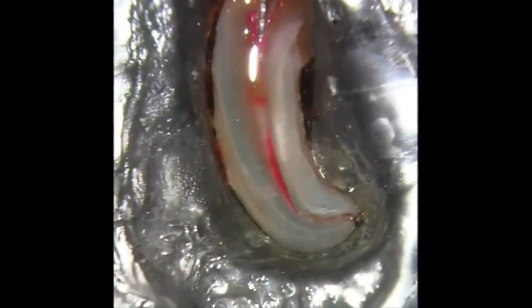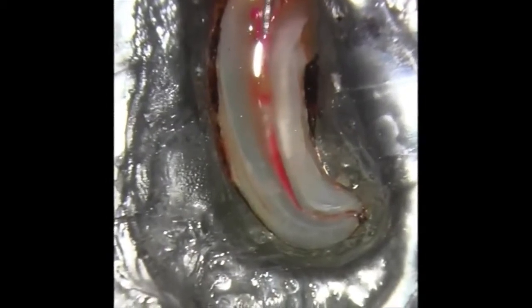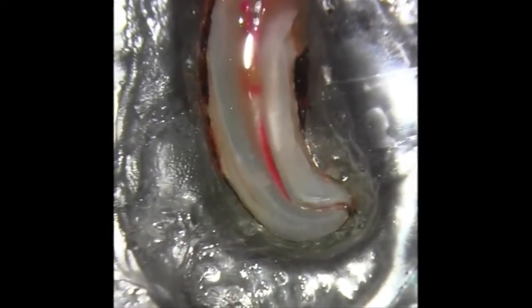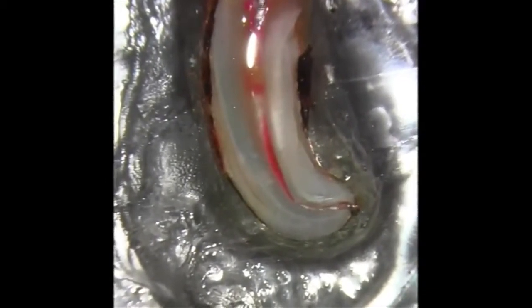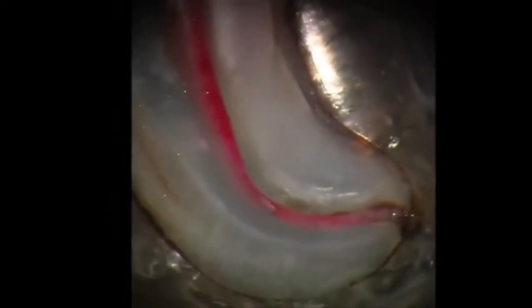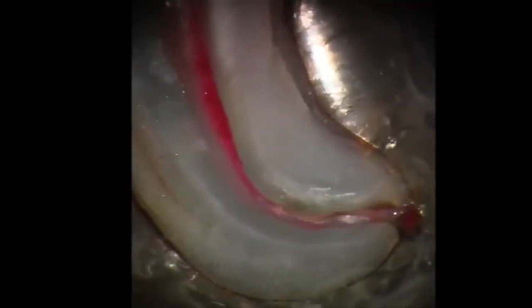As can be seen in this video, it remains centered in the canal, which now enables the clinician to use any NITI rotary or reciprocal system to enlarge and shape the canal effortlessly.